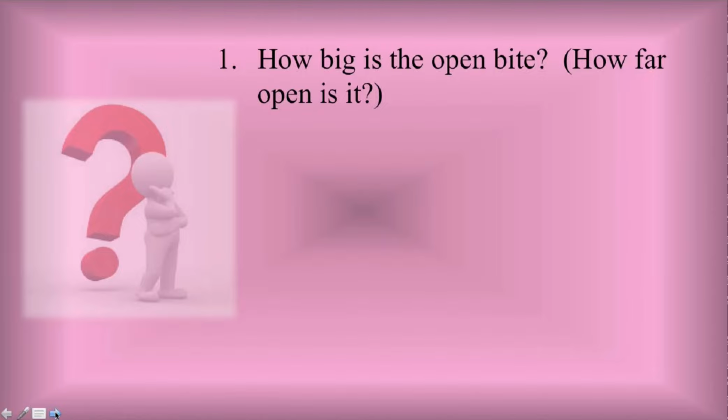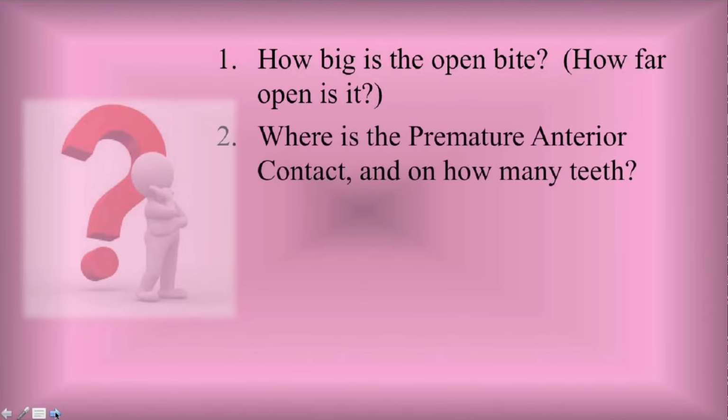I just did an adjustment yesterday on my hygienist who was in Invisalign before she moved to my practice, and she had a posterior open bite that was unilateral. She only had it on one side. Well, it turned out that she was only getting 4 posterior teeth. So we did some strategy associated with allowing those to come down a little bit, and then I adjusted slightly, and it was very easy because it was very slight. So how big is the open bite is the first question.